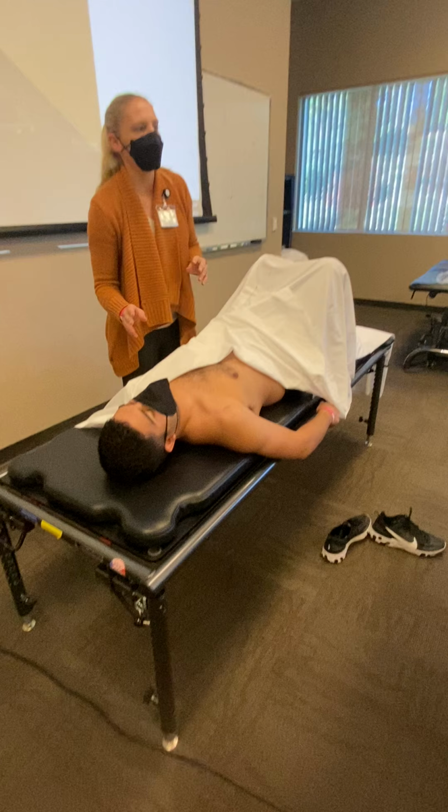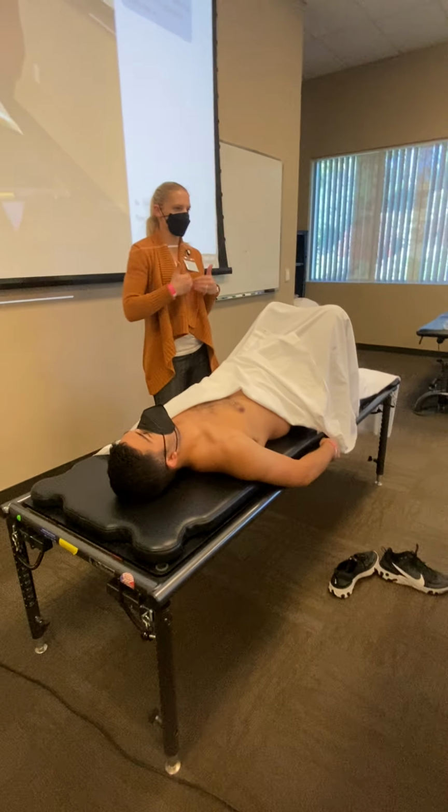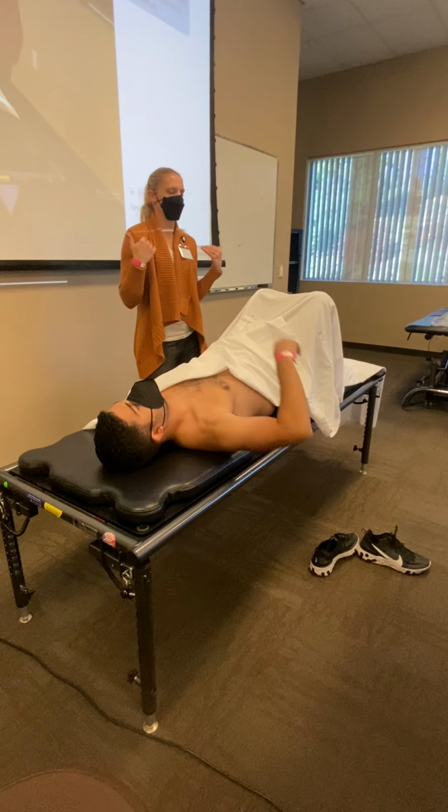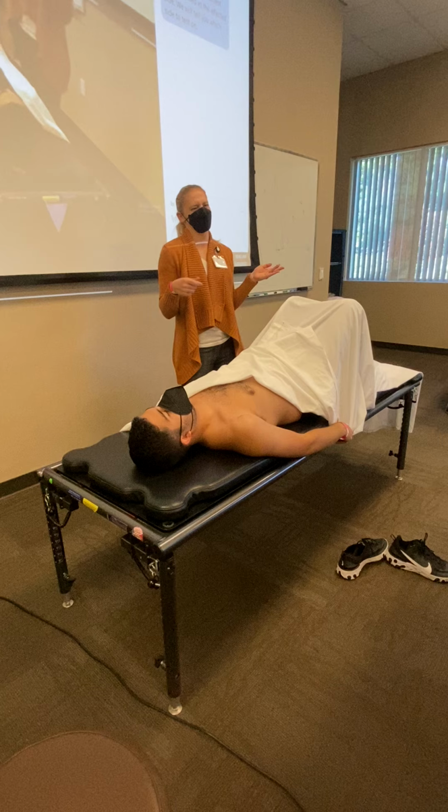So now with the pec, you have two different fibers that you're wanting to look at. You have the sternal and the clavicular head. So when you're doing, if you pull the card and you get pec major, blah, blah, blah, blah.